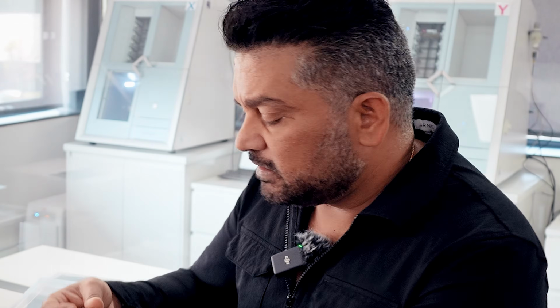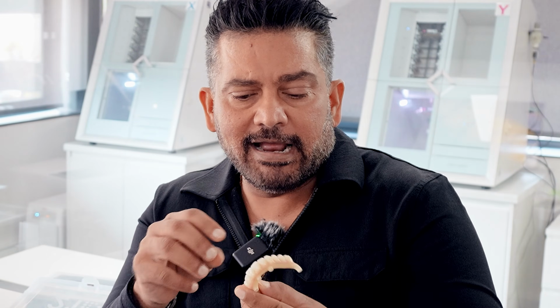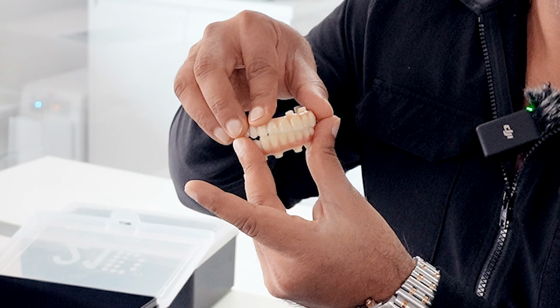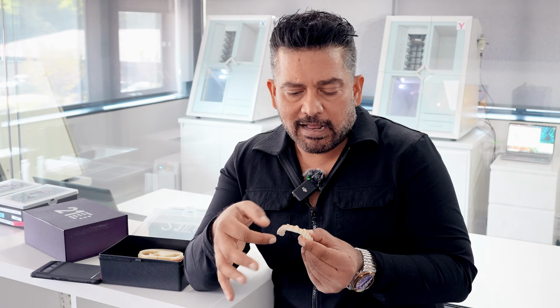We then fit on top of it something called a deprogrammer. These are what we call deprogrammers. These are the first set of prosthetics, and they are screwed directly onto the implants. They're often referred to as temporaries in other clinics, and they're designed to work like that. It will have bite engineered into it exactly where we need it to be while you're healing. And these are the devices that we use on the day of surgery, and we have these ready before you have surgery. So immediately after the implants are put in, we fix the teeth immediately, so you have no downtime where you're waiting to have the teeth made or any of that stuff.